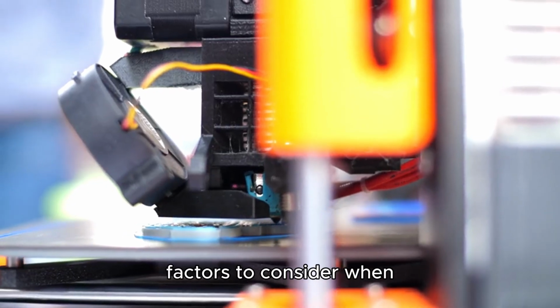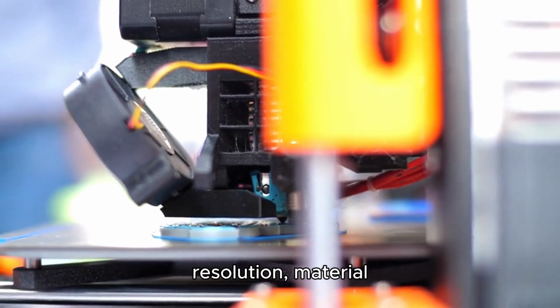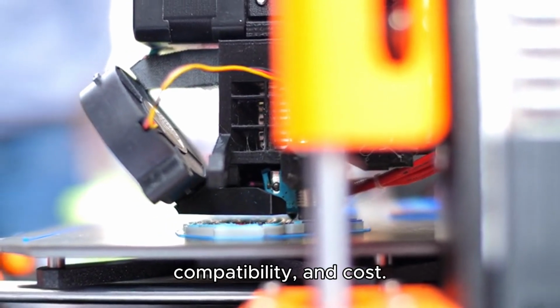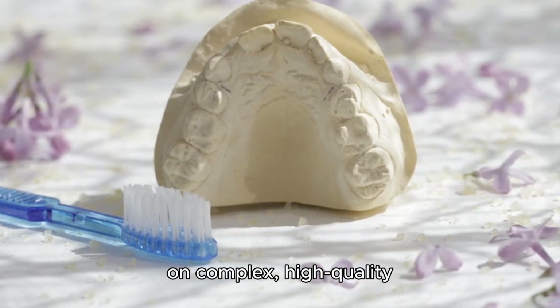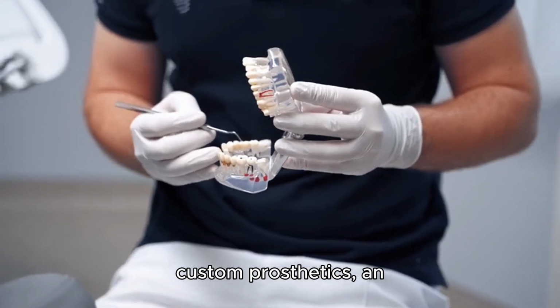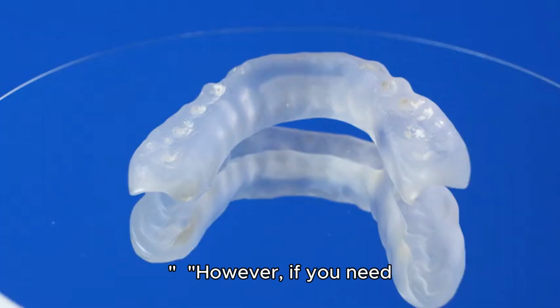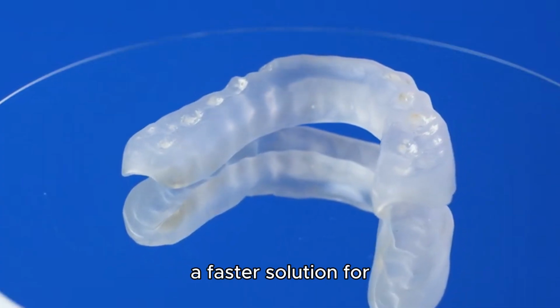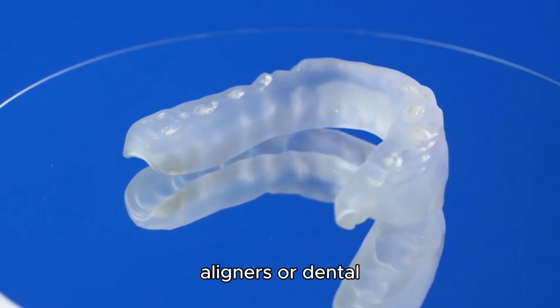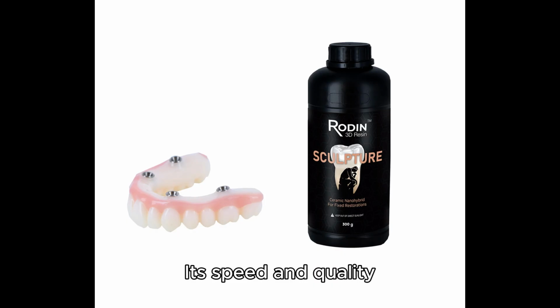There are several factors to consider when selecting a 3D printer, including print speed, resolution, material compatibility, and cost. If your practice focuses on complex, high-quality restorations like crowns, bridges, or custom prosthetics, an SLA printer might be the best fit due to its high resolution. However, if you need a faster solution for producing multiple aligners or dental models, a DLP printer may be the ideal choice. Its speed and quality make it suitable for both high-detail work and high-volume production.